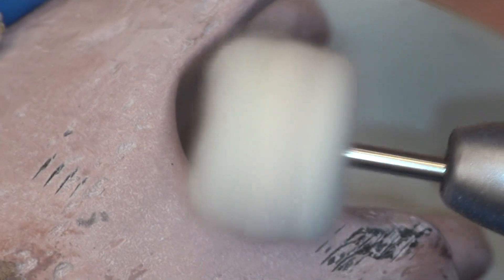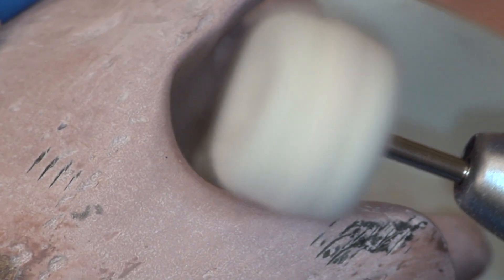For our final polish, a buffing wheel with Acryluster is used. The buffing wheel is applied to the Acryluster block for only one to two seconds. A minimal amount is sufficient to produce a mirror finish.